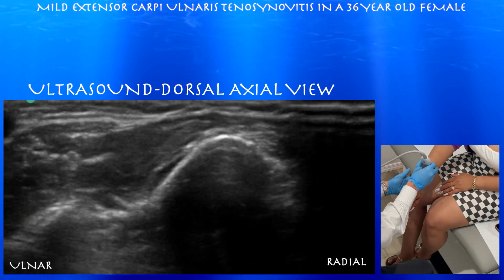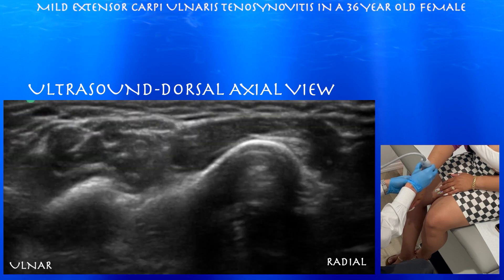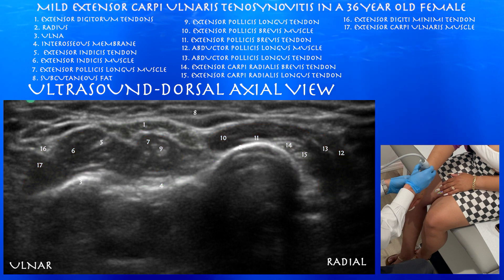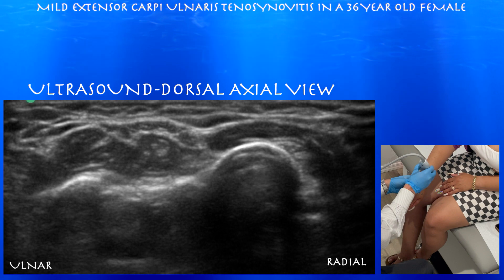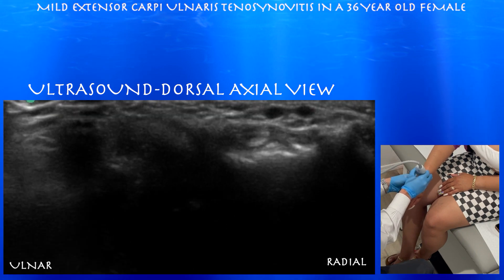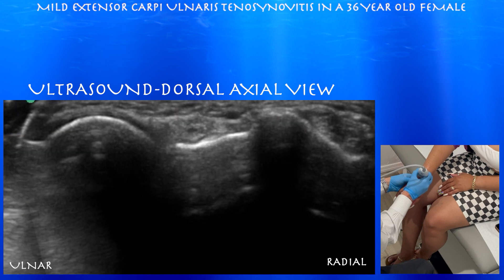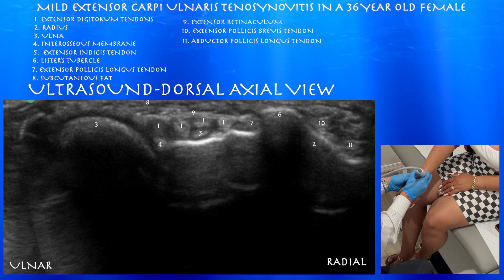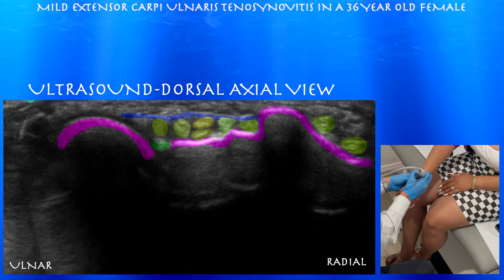The right side of the screen is radial. This is our first clip — you can see the radius. Here we're basically in the forearm musculature; we can see the extensor tendons beginning to form, but there's still a fair amount of muscle around the tendons. We can head towards Lister's tubercle. This is our home base view where we can appreciate Lister's tubercle. Just ulnar to that is the extensor pollicis longus tendon, and from that point you can figure out which compartment you're looking at. We can also appreciate the extensor retinaculum above the extensor tendons.